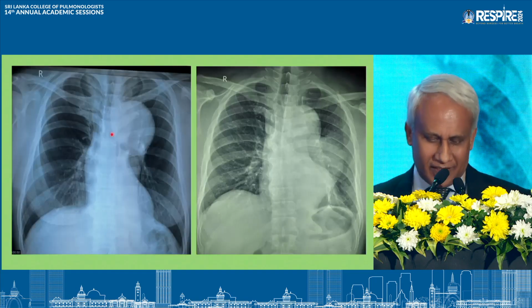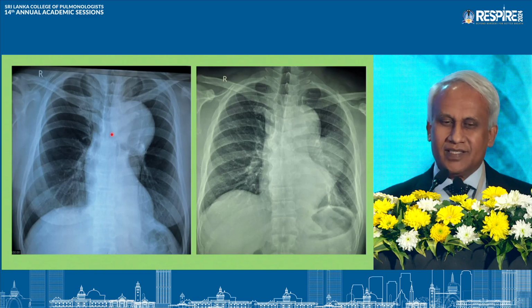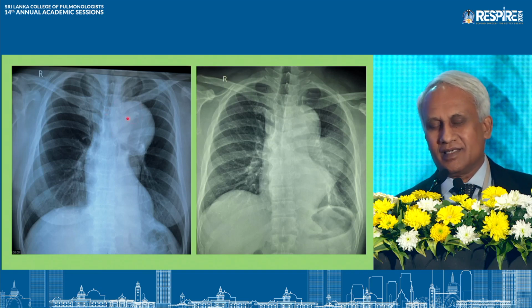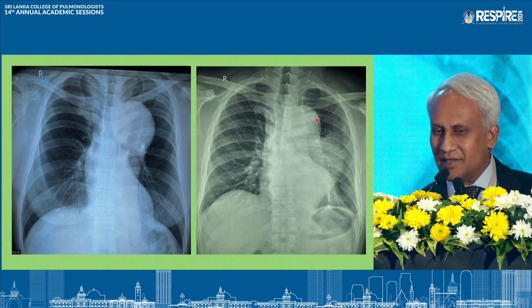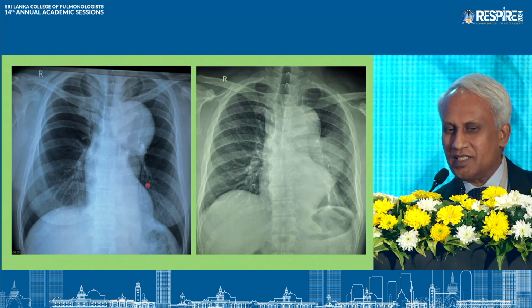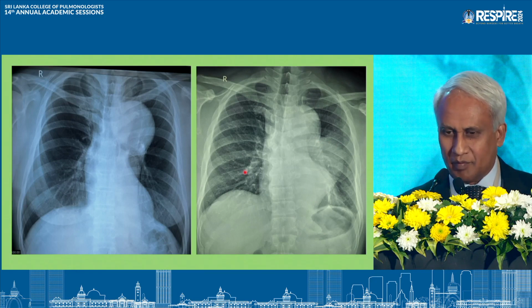Next, move on to the aorta. So always you know the cardiac size and the size of the aorta. So you should have seen a lot of X-rays to appreciate that. So you can see big aortic knuckle here. And here again, I can't demonstrate the left descending aorta here. The aorta is coming in this way. So both these patients have dissecting aortic aneurysm.